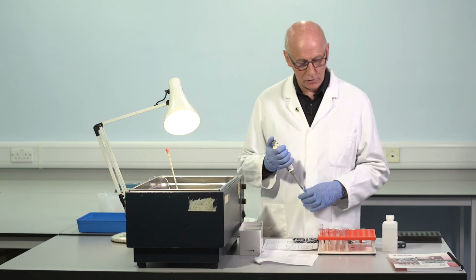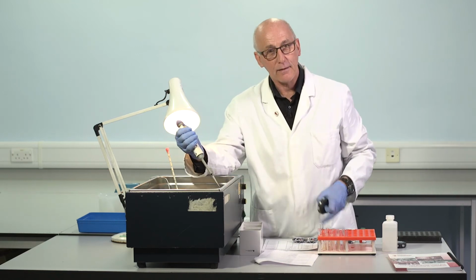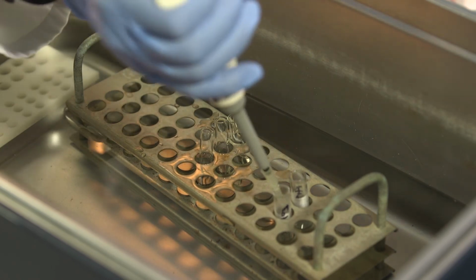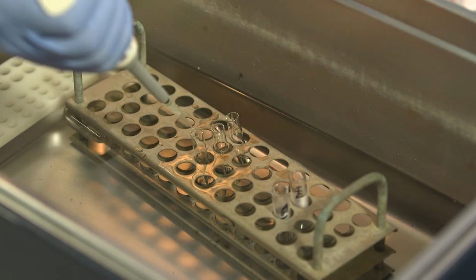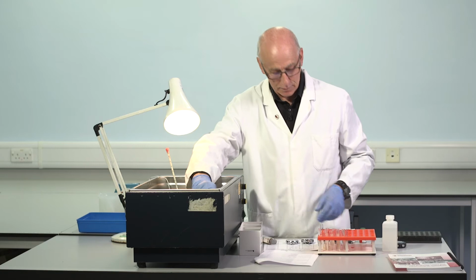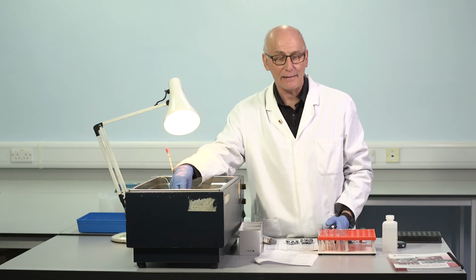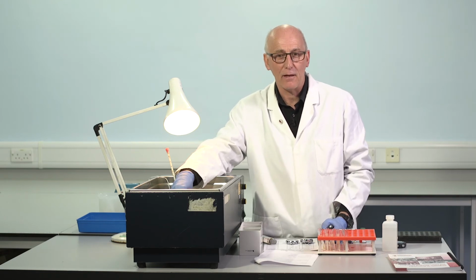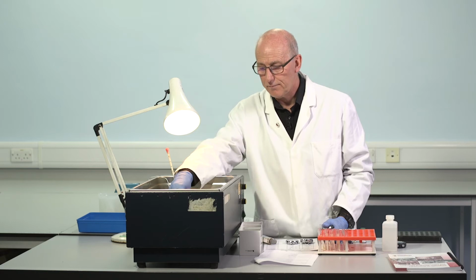If we get hemolysis during the collection and processing, then this can affect the results of APTT and may also have an impact on the results of factor VIII assays. Hemolysis in the sample, artifactual hemolysis, that can lead to activation of clotting factors. We may have enzymes present. We may have some activated factor VIII generated in the sample. And this can affect the results. It can influence the degree of parallelism between the dose-response curve for patient compared to the standard. These may not be parallel where active clotting factors are present. So that's another reason why 3 dilutions can be really useful, so we can assess this.